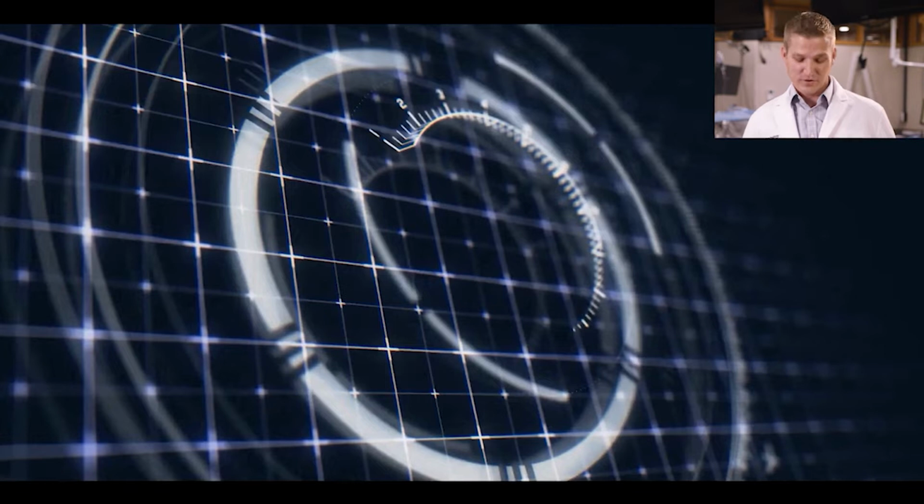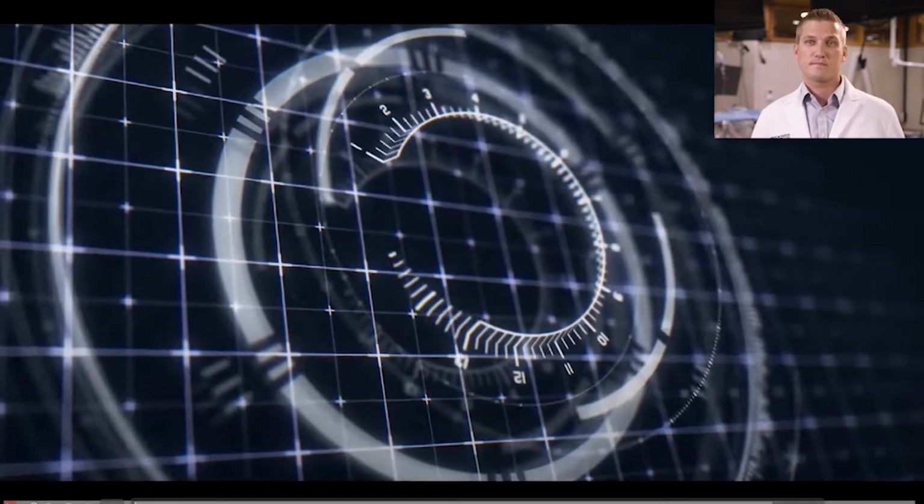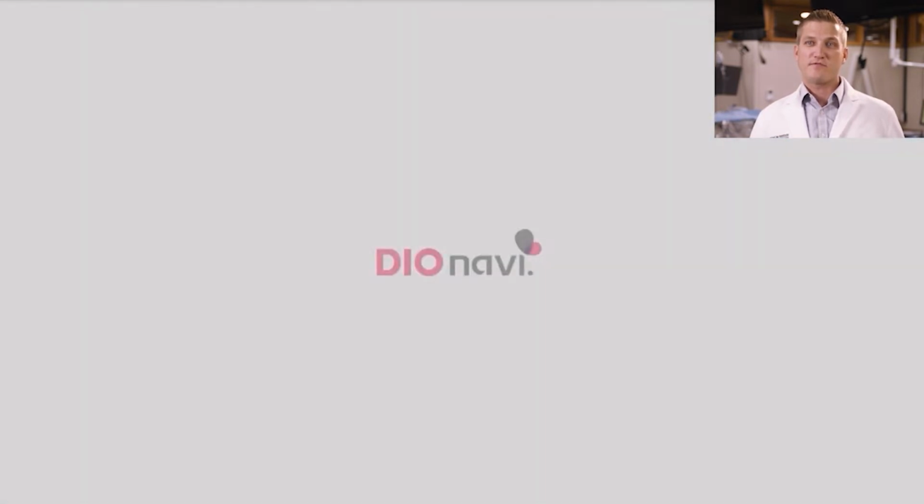I want to play this quick little video for you to get started, okay? Here's a fun little video. I'd like to go through it. It highlights some of these technology pieces that really sets DIOnavi apart.